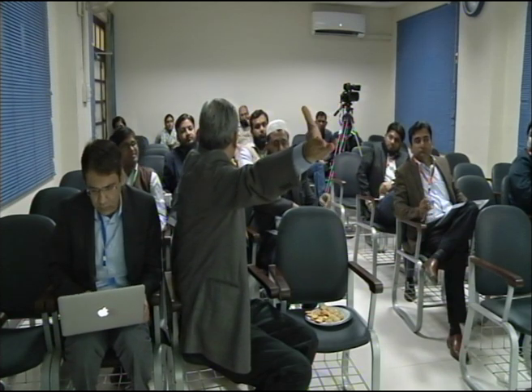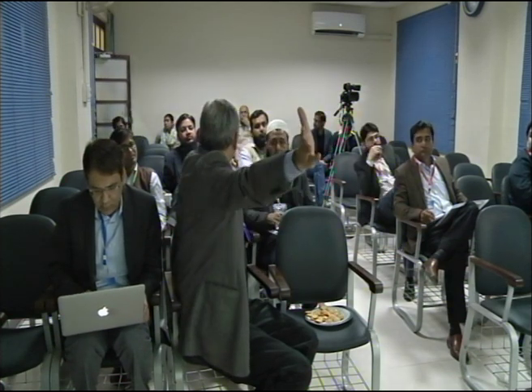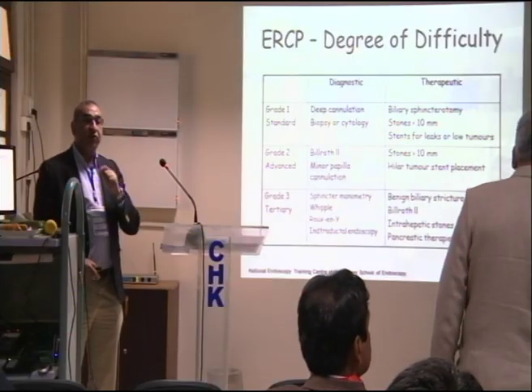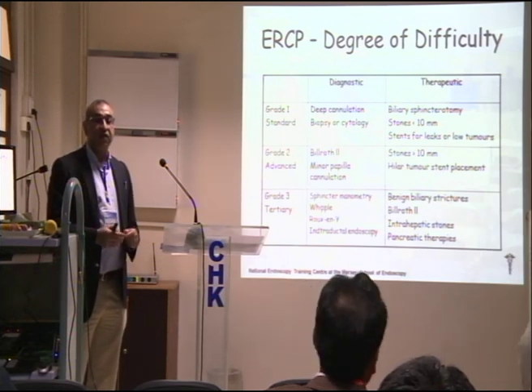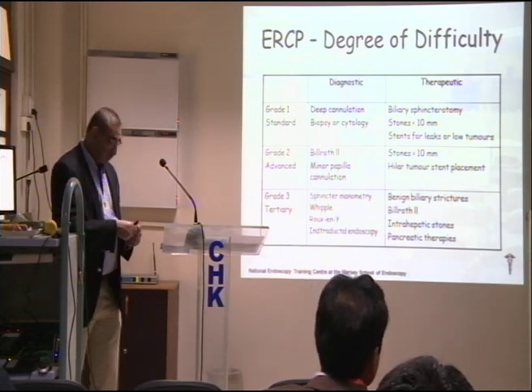So 10 mm से कम में तो आप कभी sphincteroplasty करते ही नहीं हो. So you are already in advanced grade anyway. So obviously that's important. In fact, in the UK sphincteroplasty was only started a few years ago. It wasn't licensed to be done.